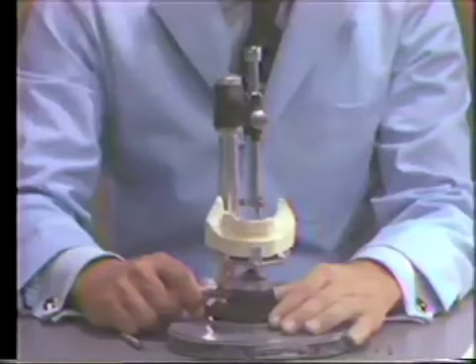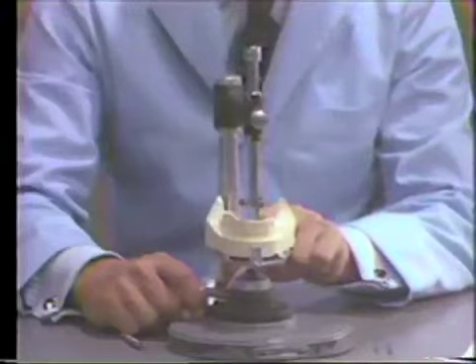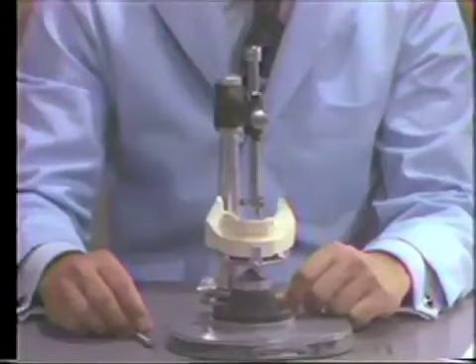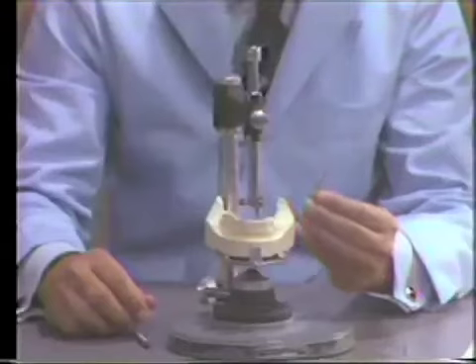and what I want to check now is the potential tooth where I don't want to do a restoration, the bicuspid tooth. I want to check and see if there is an adequate undercut. Now, what I'm going to check that with is an undercut gauge.